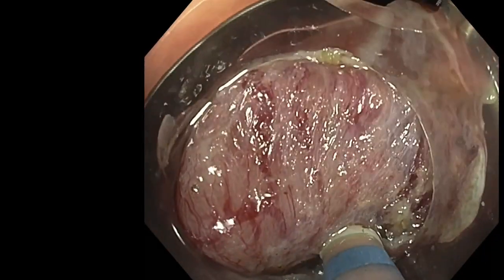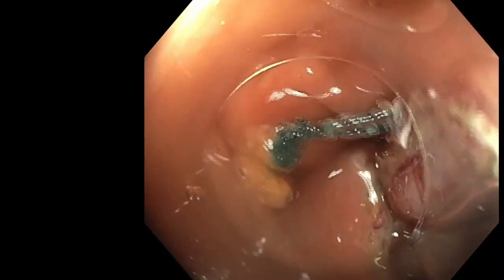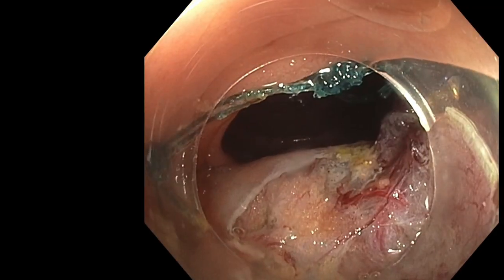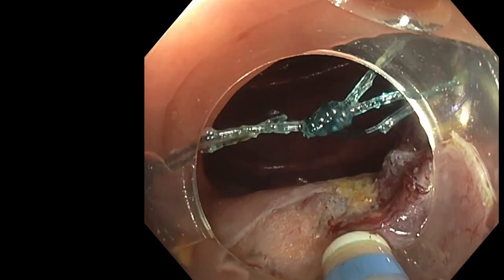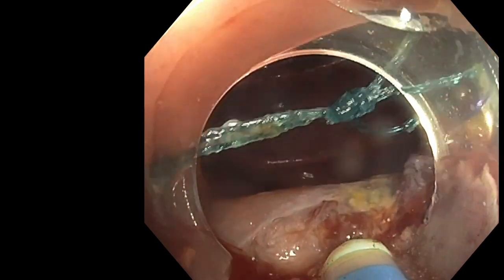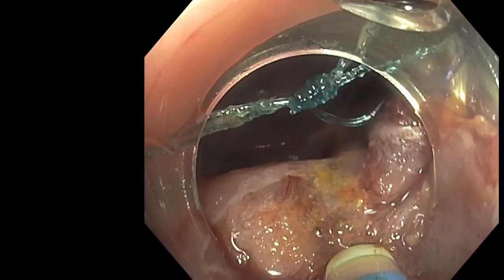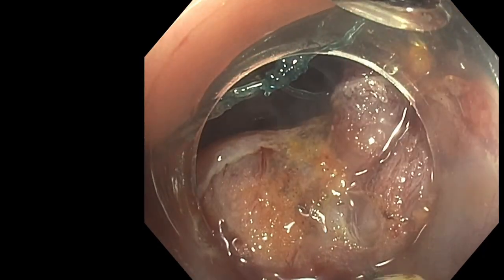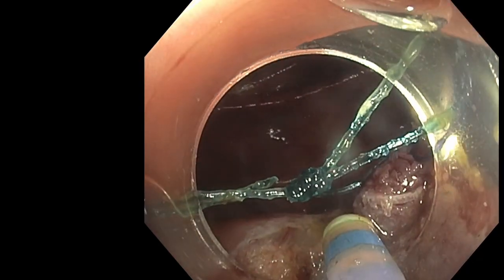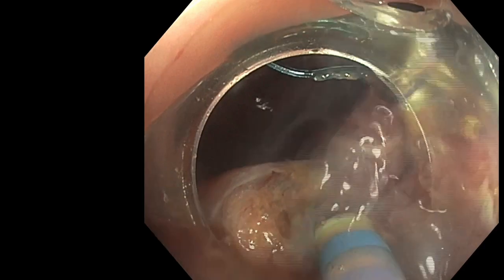Removing all the fixation, the adherence of the diverticula around the central part will make your success later in the procedure, and it's sometimes, thanks to traction, possible to turn around and have a kind of lateral approach like this, cutting the submucosal fibers from the lateral side, and removing the tension in the oral edge of the diverticula.